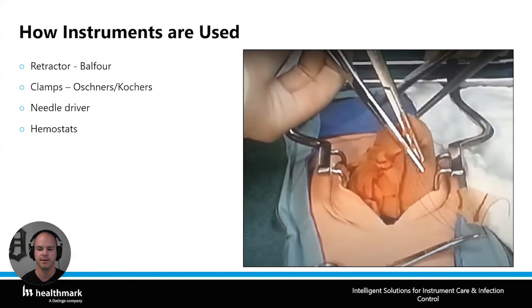And then here they're starting to put the bowel back together, and that's where they're using the suture, and eventually they're going to use an automated stapler device and all of that. That's not as important to know, but you can see how all of these instruments are being used, and I think that's really helpful for understanding the instruments, why they're so important, why we need so many in a certain set.